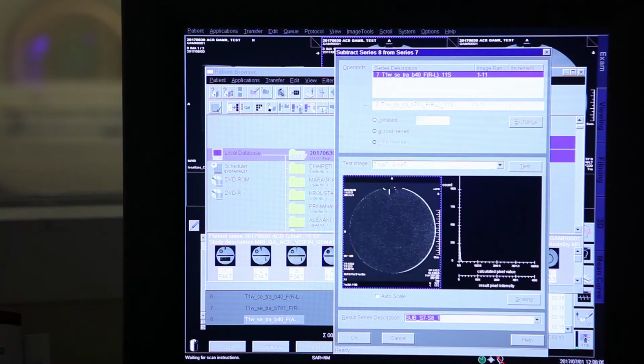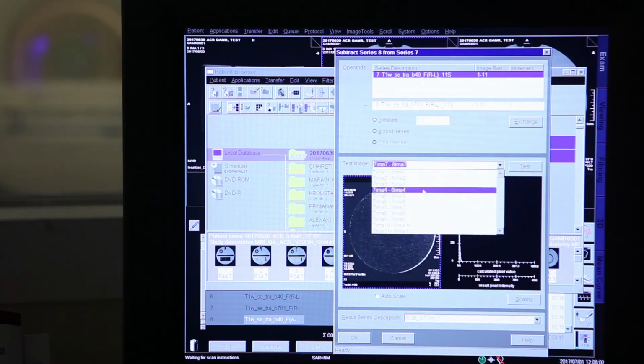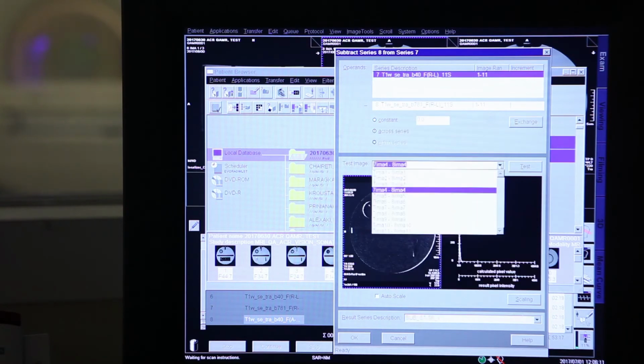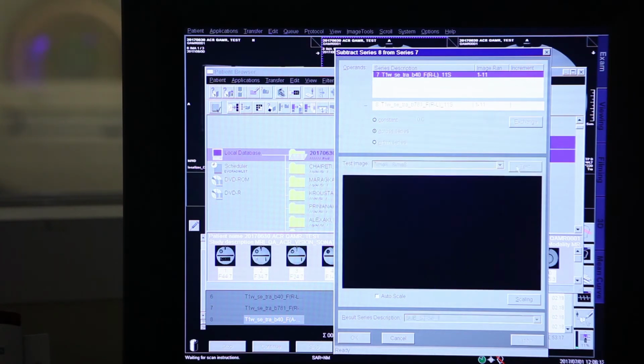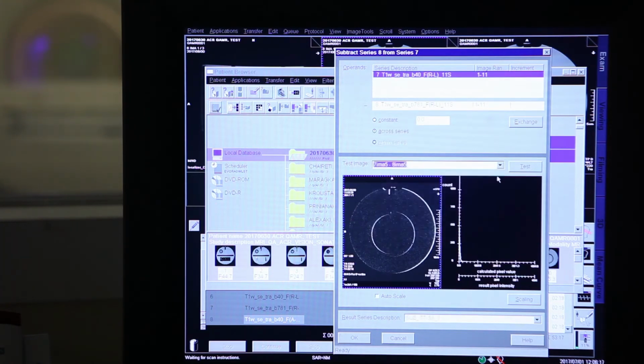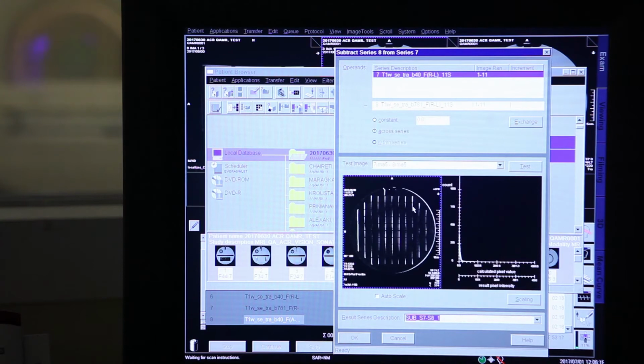Where's the grid? It's not here. I'm going to show you something here. Number 4, and an important issue. It's 7, 8 probably, no, it's not 8. Now we're going down, so it's number 5. There it is. I can see a dark circle. Am I mistaken? No, you're not mistaken.